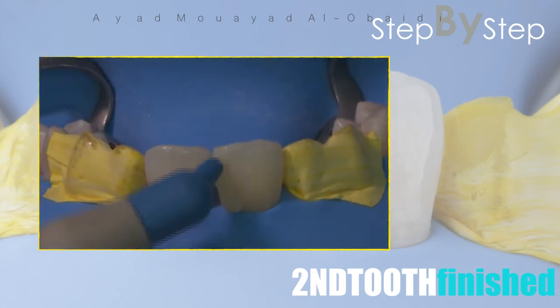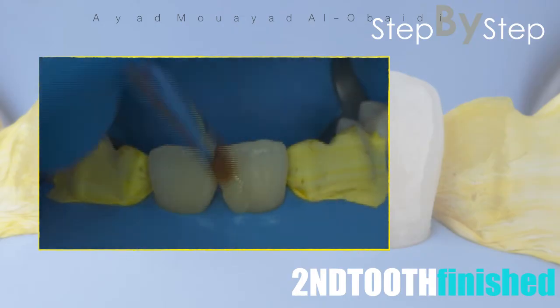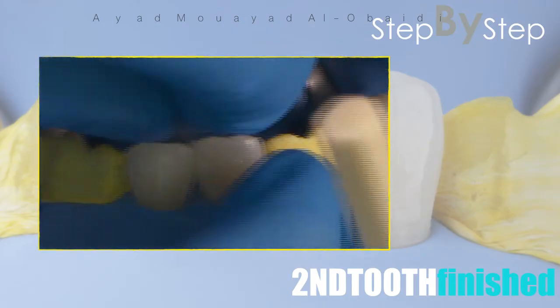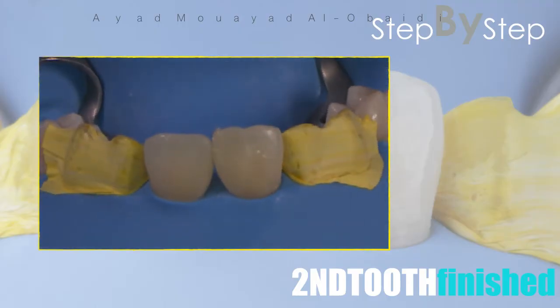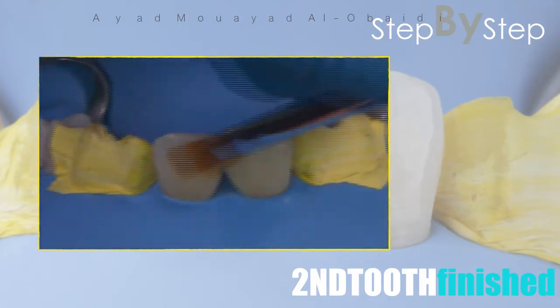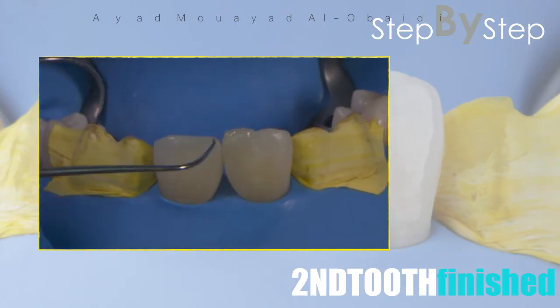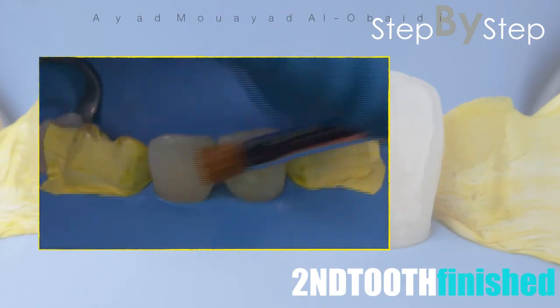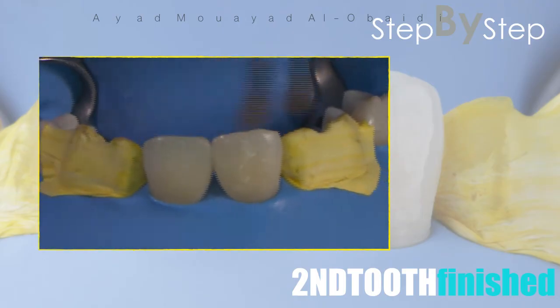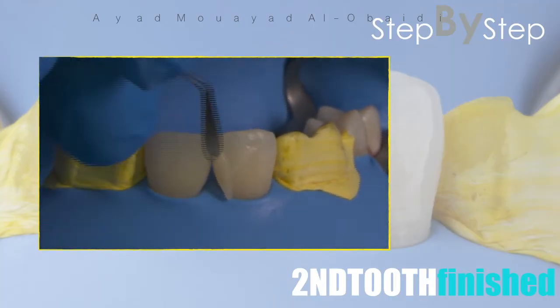If there is any deficiency in the buccolingual direction, we can apply another layer of body shade composite, contour to remove excess, and use a brush with primer to level this layer.